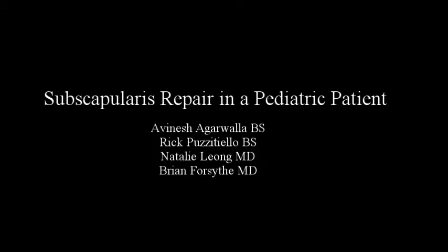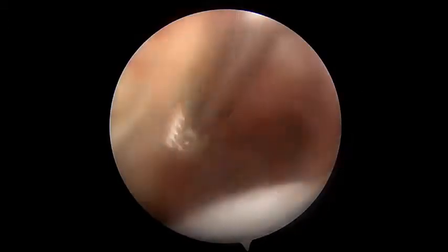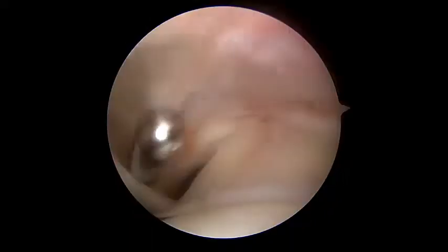The following is a 15-year-old football player who sustained a traumatic avulsion of his subscapularis tendon. He is in a beach chair position with the arm placed in a spider holder. We establish standard posterior and anterior portals.